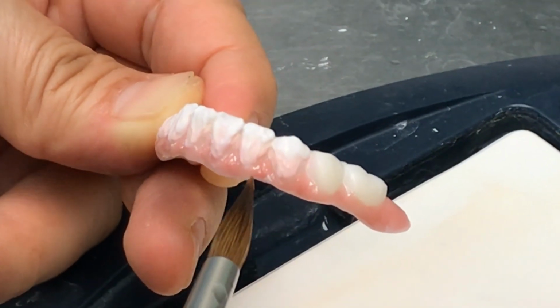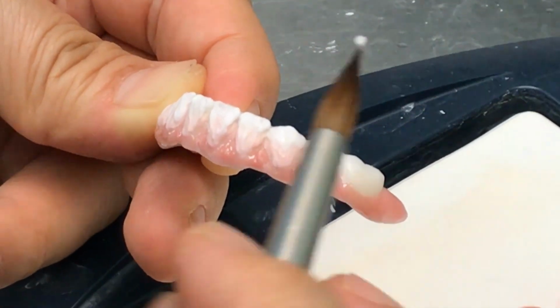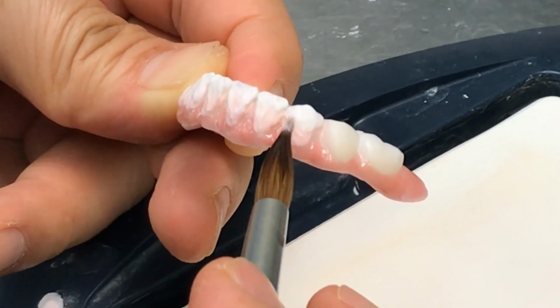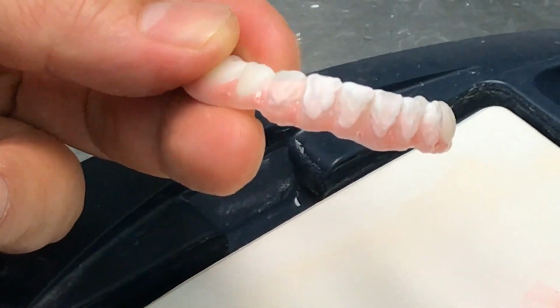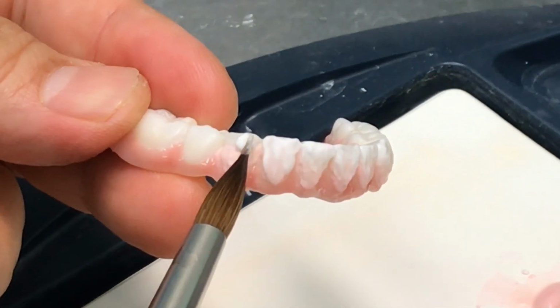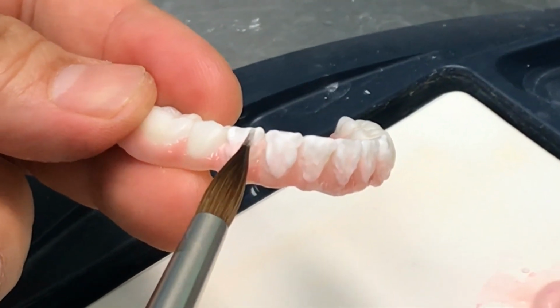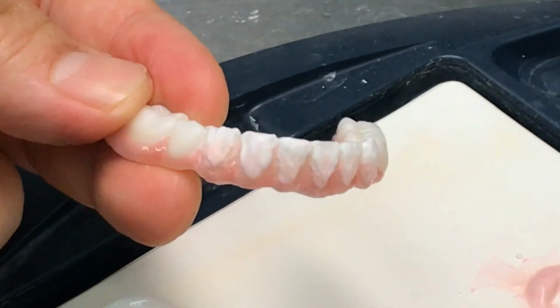So I'm going to fill with the pink after I fire it. Right? And then the other is canine as well as the EOP4 enamel over color, which is my favorite color.